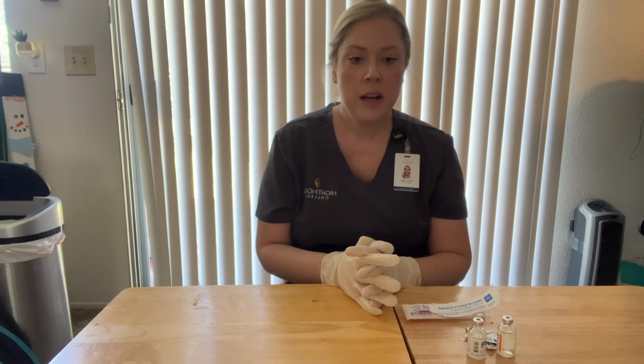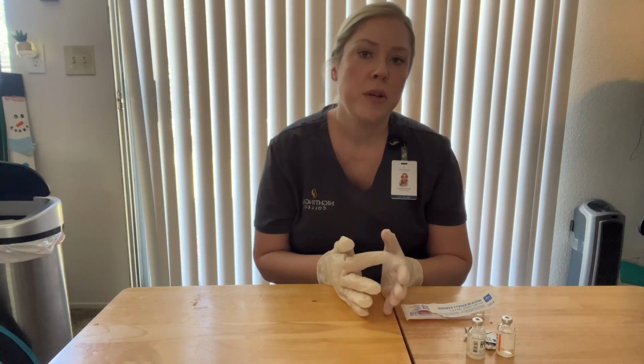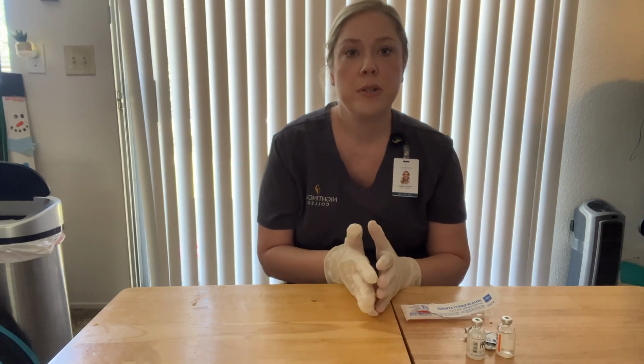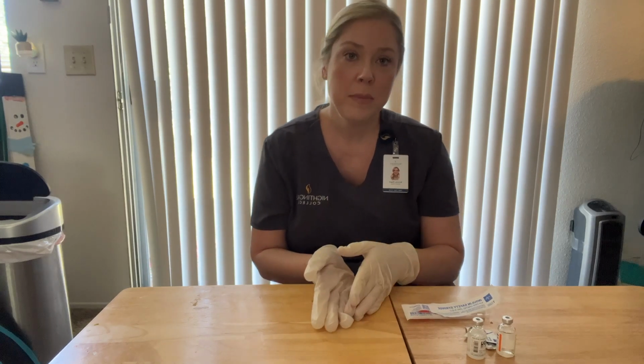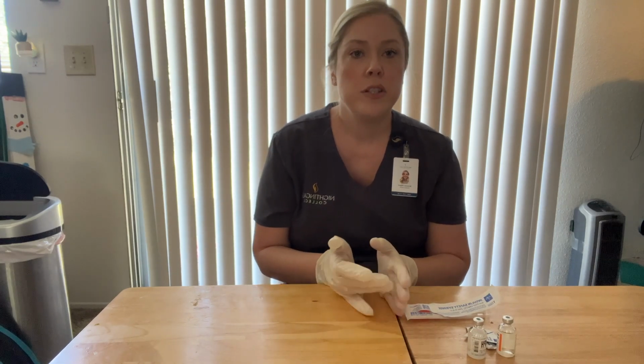Okay. An appropriate blood glucose level before a meal is usually between 80 to 130 milligrams per deciliter. So we took Mr. Smith's blood glucose level. It was 110, so I would give him his insulin, and then I would want to bring his breakfast tray within 30 minutes of that administration.